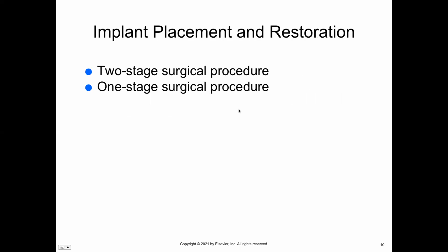When it comes to implant placement, the best way to figure out the ideal position is by using a CBCT image or cone beam. Cone beam, remember you guys, is a 3D image. X-rays that we look at are only 2-dimensional. So this is a 3-dimensional image that can help show bone density in different areas. And this also helps to provide the proper angulation for the implant being placed.